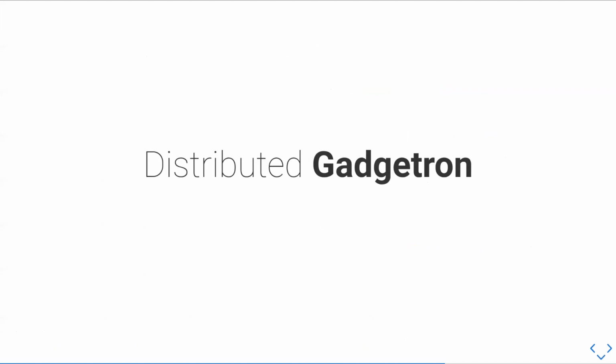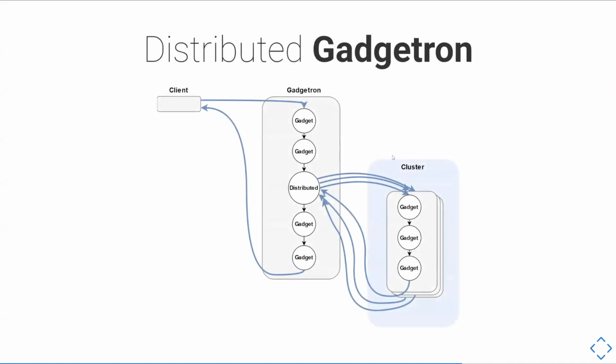And that leads us on to the next topic, which is distributed Gadgetron. So Gadgetron can distribute a reconstruction. So you have the main Gadgetron here that's receiving data from the client, and then they're going through the initial gadgets. But then they reach this distributed node, which sends the data out to a number of other Gadgetron instances on a cluster. They process the data individually and send it back. The main Gadgetron does the post-processing, sends it back to the client.